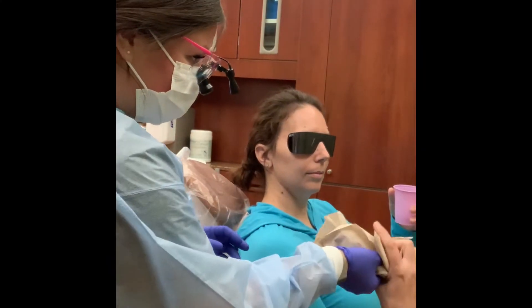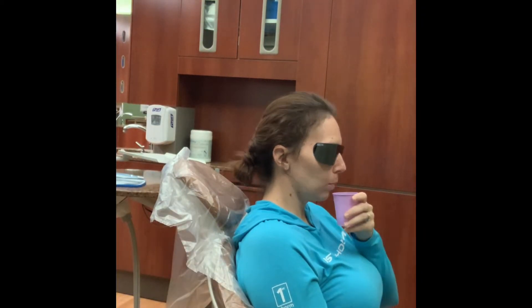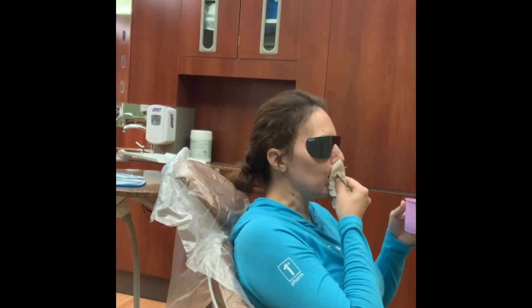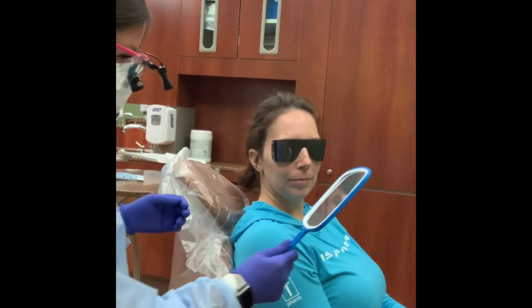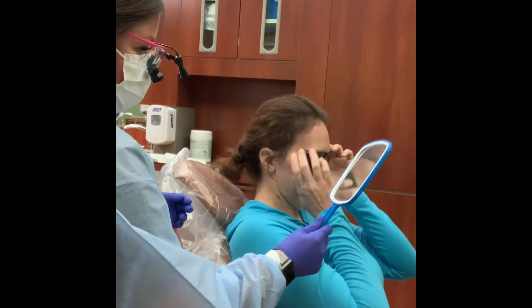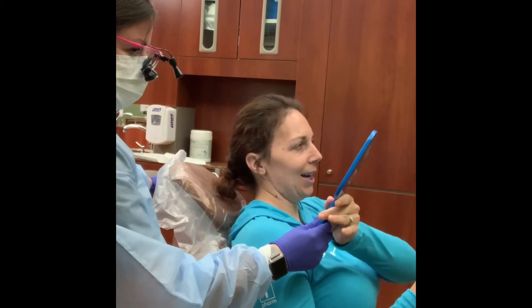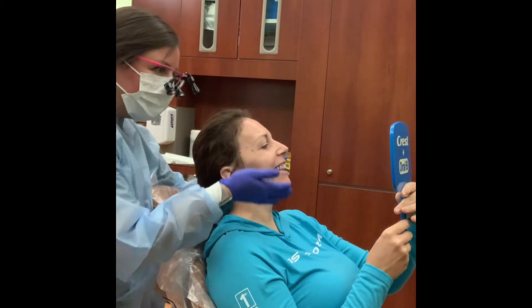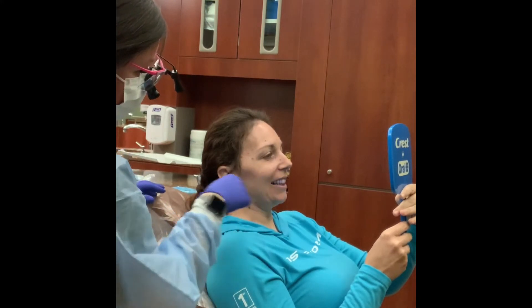After applying the gel to all tooth surfaces, instruct the patient to lightly rinse with water. Using the stain left behind, you can now give the patient specific oral hygiene instruction. You can point out areas that they are missing and give them specific pointers on how to reach those areas.